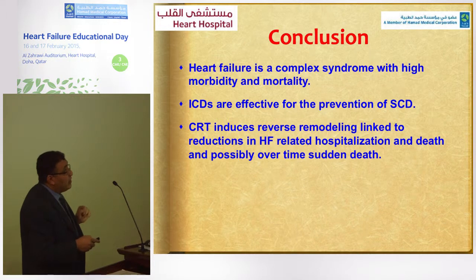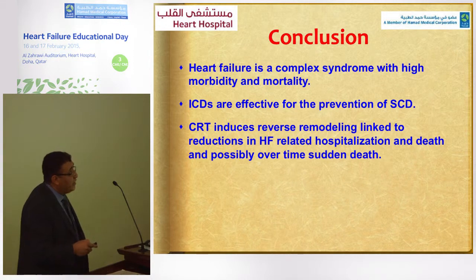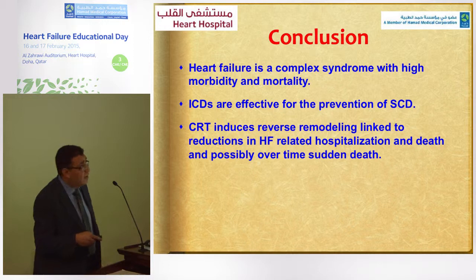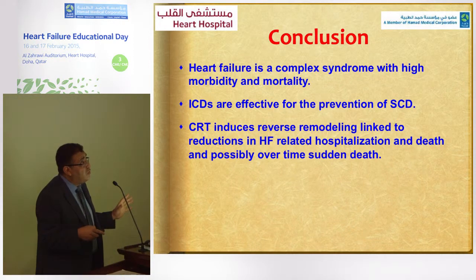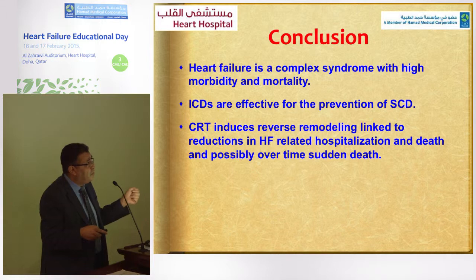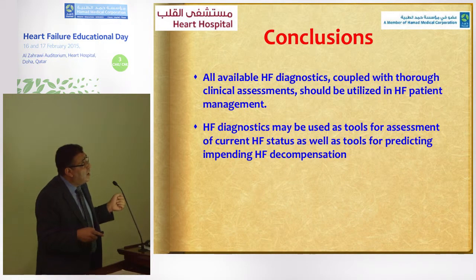So in conclusion, heart failure is a complex syndrome with a high morbidity and mortality. ICDs are effective for the prevention of sudden cardiac death for primary and secondary prevention patients. CRT-induced reverse remodeling is linked to reduction in heart failure related hospitalization, death, and possibly over time sudden death.